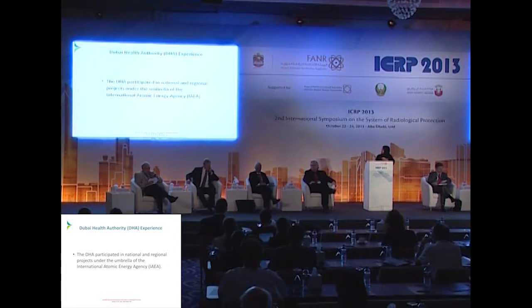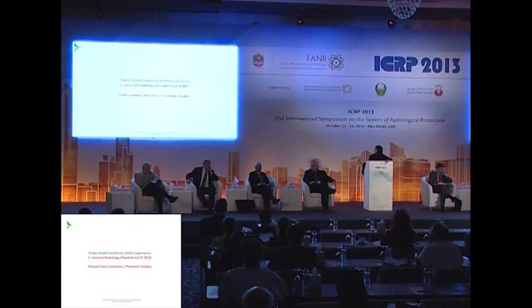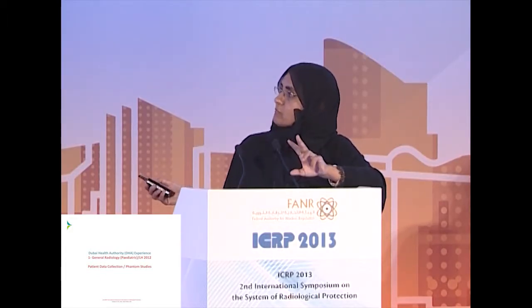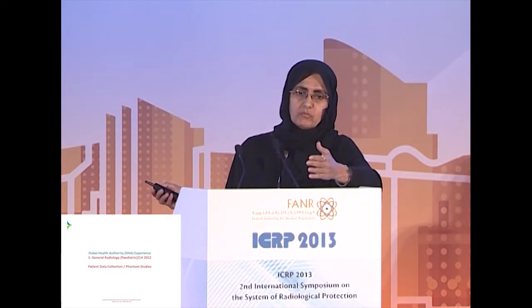Here, I come to the experience of the DHA in evaluating patient doses. In general radiology, we carried out a study in a pediatric hospital, and the method we used was patient data collection and phantom studies.